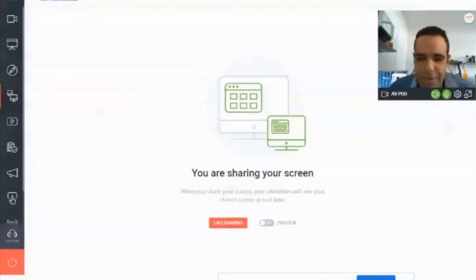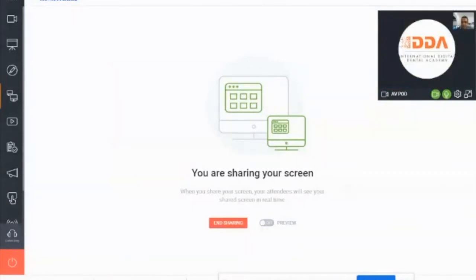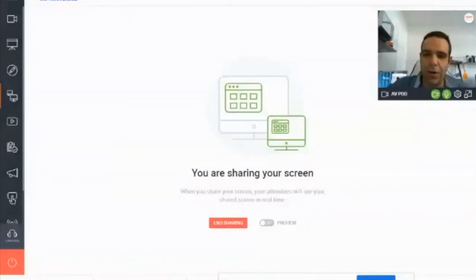Ray, thank you so much for sharing your generous knowledge with us today. It's really nice to see that Blue Sky Bio has so much to offer. And as you say, it's all for free until you can export. It gives you the opportunity to really learn without having to incur any fees initially. And when you're ready, you can move down the route of doing the exports and using them. Just as a comment, Chris, the crown and bridge will be free. Oh, yes, you did say that's free. Zero cost, always. There are no plans to monetize it anytime soon.